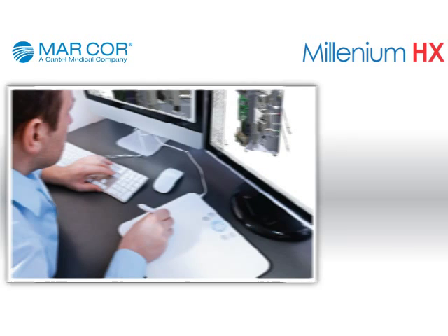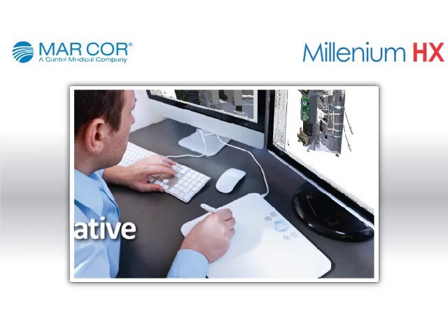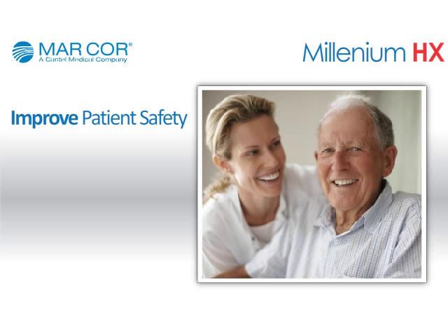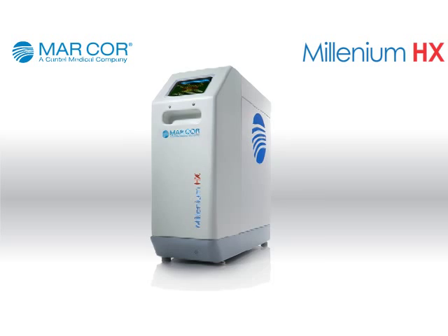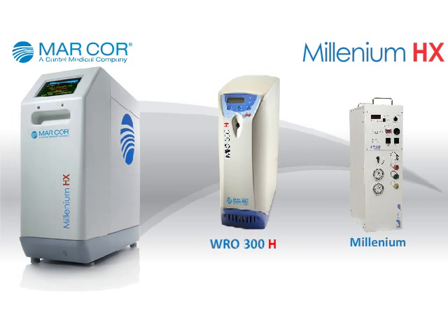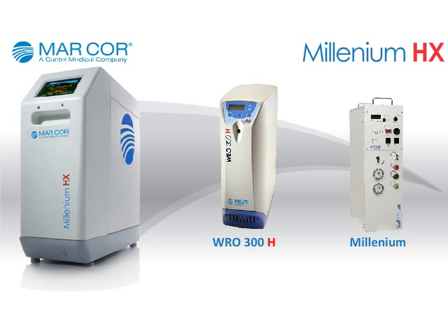MarCore continually strives to develop innovative technologies designed to improve patient safety and increase provider productivity. As a result, the Millennium HX RO device represents a quantum leap in reliable water treatment production.